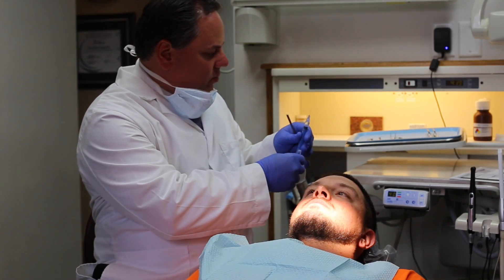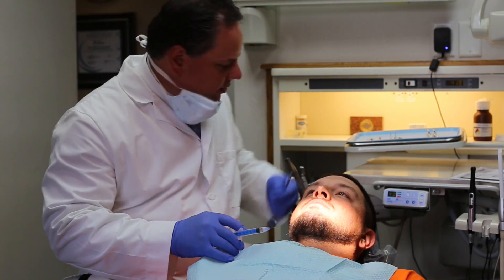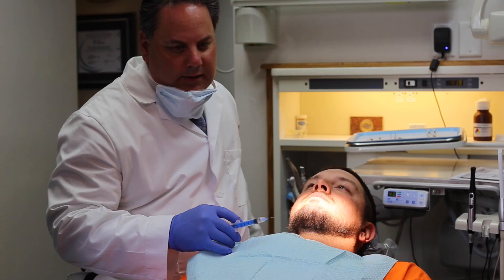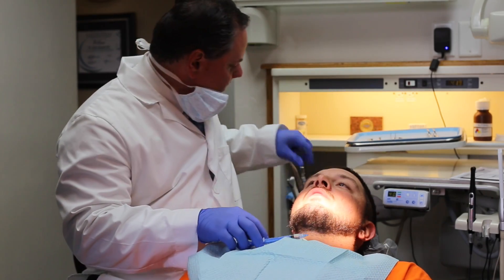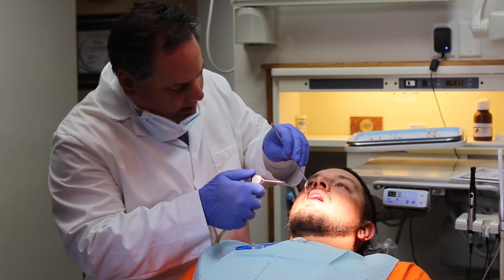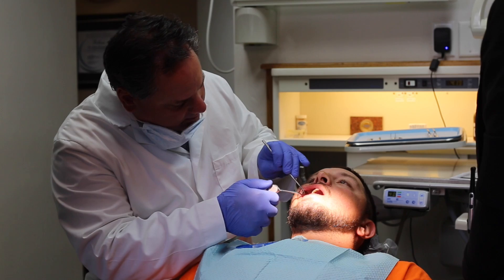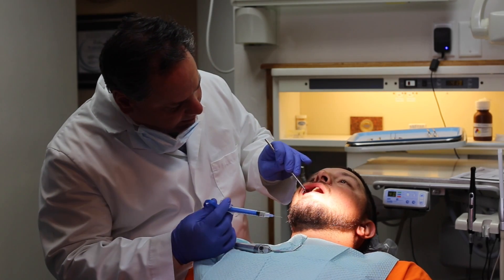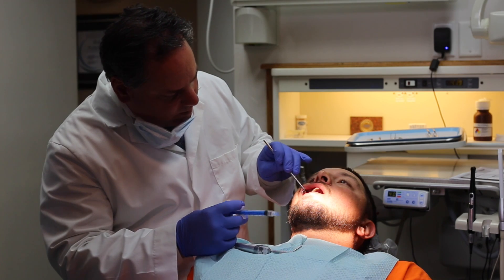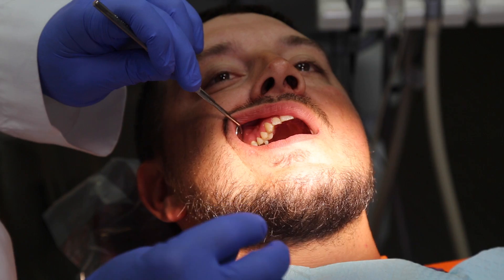You'll see that she actually only drew up one ml of solution. Typically a normal carpule of anesthetic is 1.8 mls — this was only one. What we're going to do first is just gently dry off the tissue adjacent to the teeth, right towards the apex of the roots. They're about 21.5 millimeters long, so we're going to be right where the attached gingiva meets the vestibule.